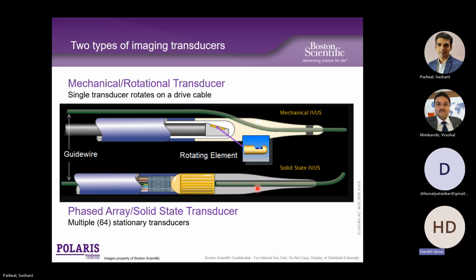Sir, how is it that solid state is better in CTO? They mentioned that solid state catheters are better in managing CTO. Yes, there was a concept earlier that the shorter the distance between the tip and the transducer, the better. Can you see the entry tip and the transducer distance? This distance is very, very critical when it comes to managing a CTO case, because in CTO you want to park the IVUS catheter in the proximal side branch.